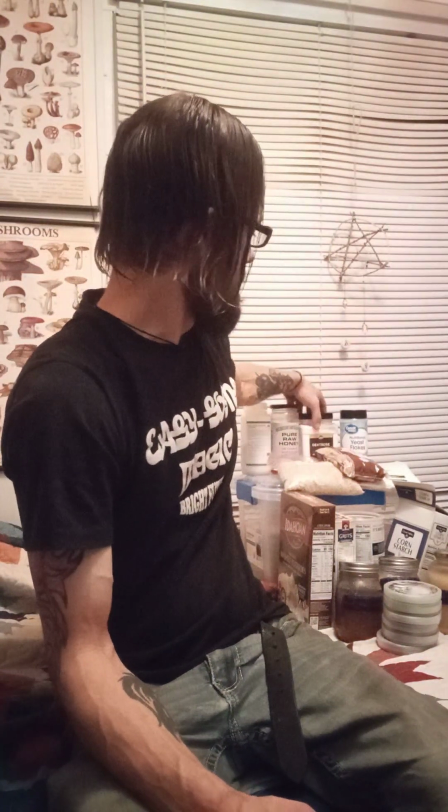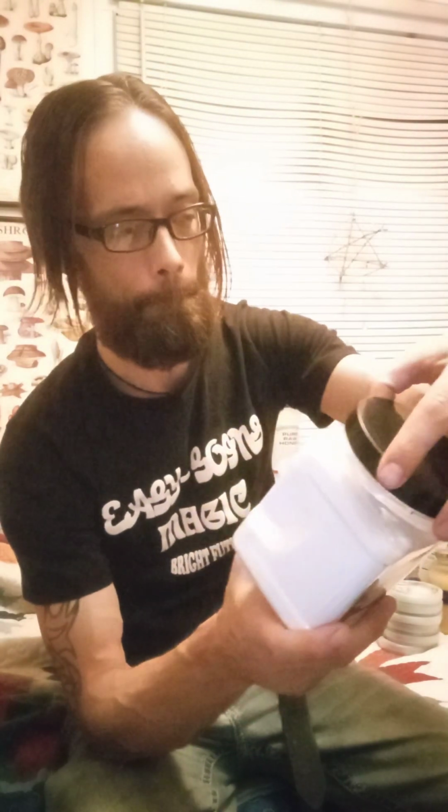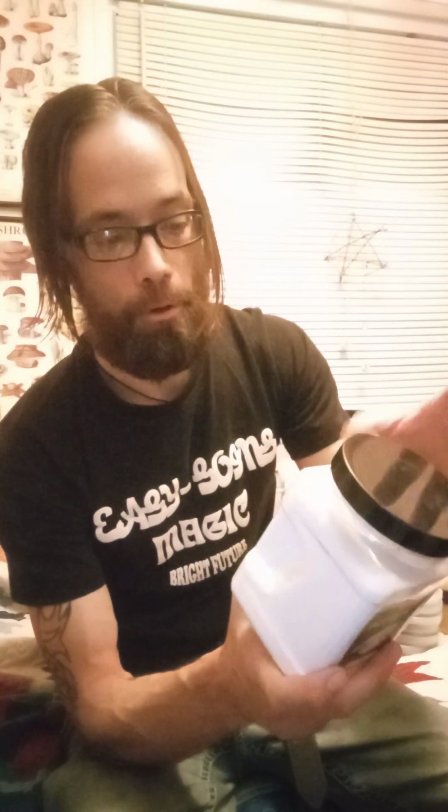So, when it comes to the different nutrition sources that we use, pretty much everybody knows what corn dextrose is. This stuff is so widely used, and there's a good reason. It's a good, clean sugar source, pretty devoid of anything else. It's basically just corn sugar. Per 20 grams of this, you're getting 18 grams of sugars. The rest is just a devoid powder. This is fantastic to use.